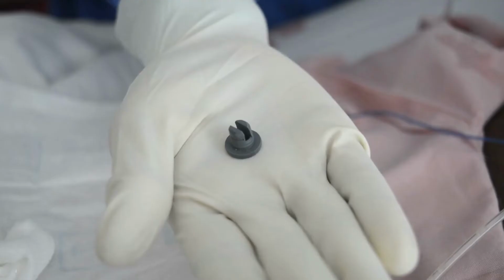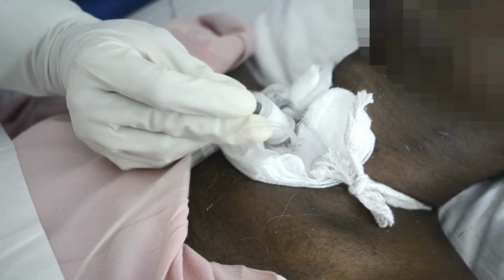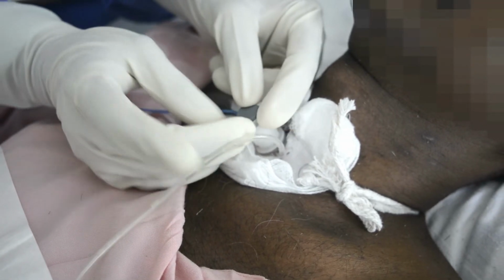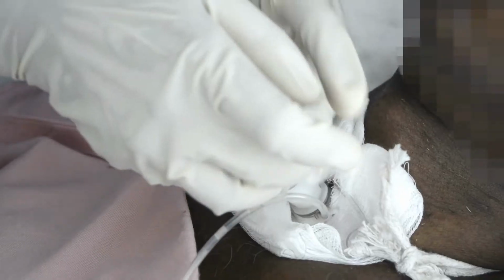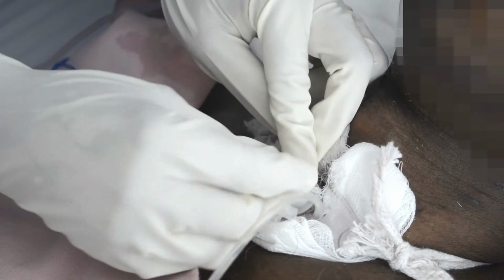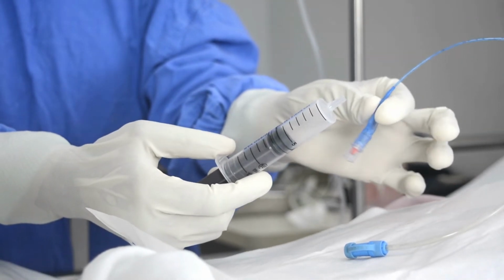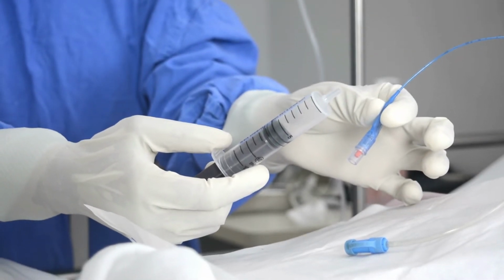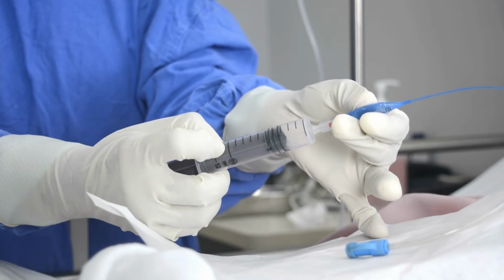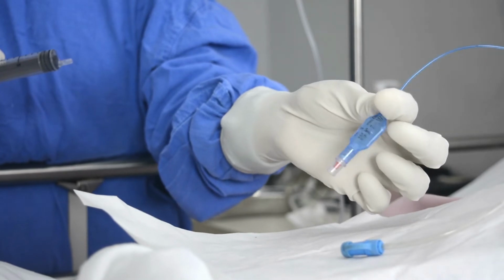Now, if doctors have asked for corking, this is the routine sterile cork that we use. This makes the opening perfectly fit. There will not be any air leak. Secure it with micropore. This is done before decannulation, for the trial of decannulation. Now she is removing the tracheostomy cork and inflating the tube. Make sure of the cuff pressure. Ensure it is 5 to 7 cc. Ideally it should be checked with a pressure manometer.